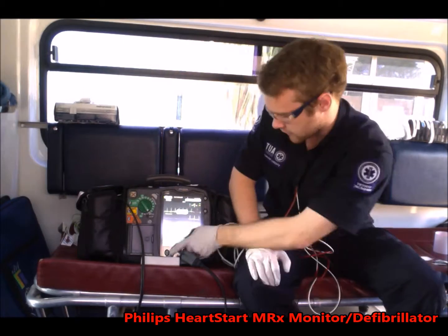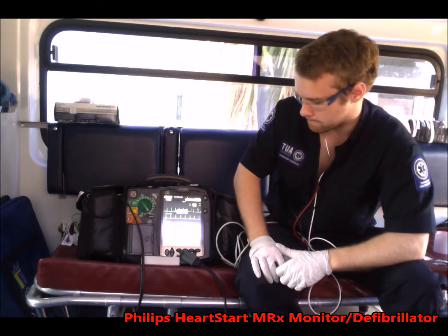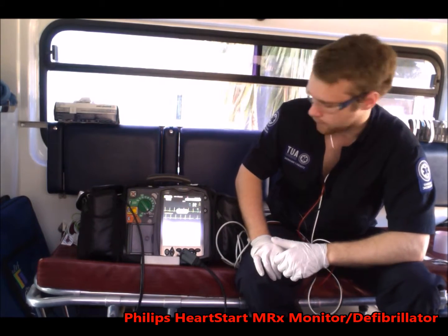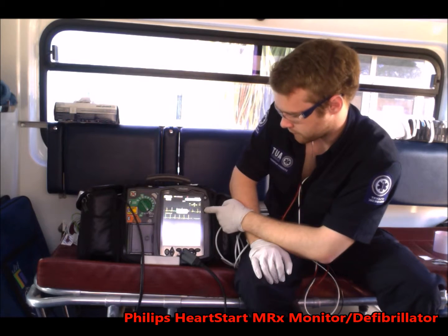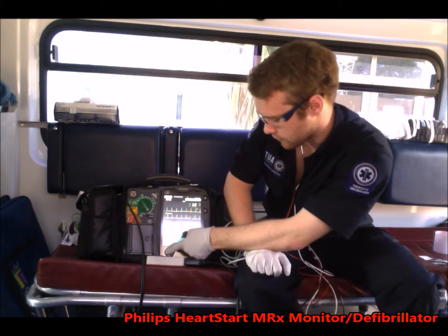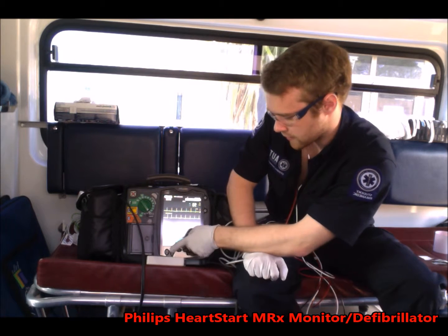So as you can see, it's detecting the electroactivity of my heart, and we can change between the leads by pressing this button here. We can adjust the QRS volume by going in through the menu, going down to volume, QRS, and we can change the different volumes.